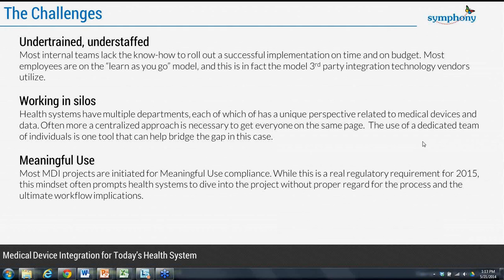Okay, so that's all you do. Well, that technically would meet the requirements for meaningful use for 2015 because you are taking care of all those elements that they're asking for, because they don't specify on what scale this has to occur. You can do a fairly limited implementation and still meet requirements for meaningful use.